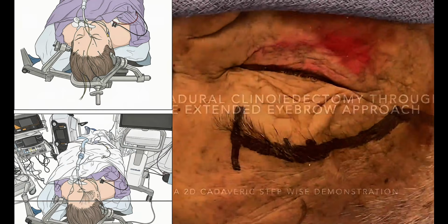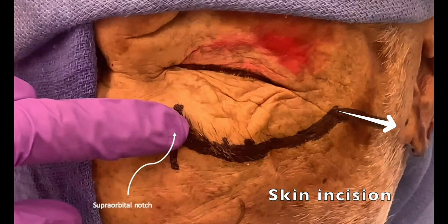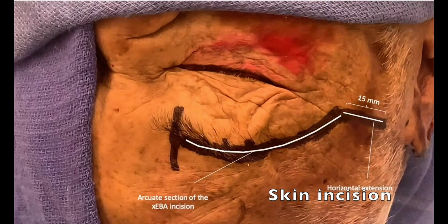The head is positioned with approximately 15 degrees of rotation and a slight extension. An eyebrow incision extending from the supraorbital notch to the external epicanthus is performed. Then we follow and extend this incision through the skin of the temple, following the most prominent wrinkle.